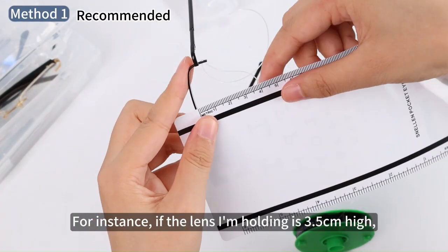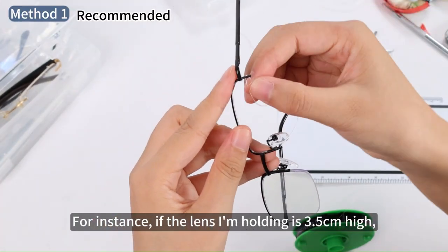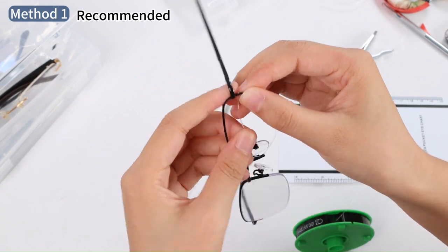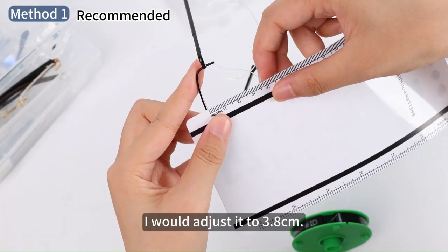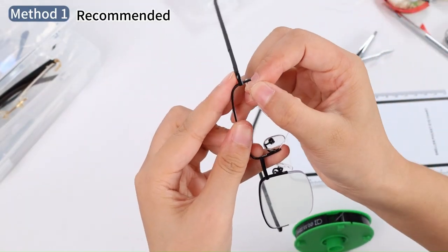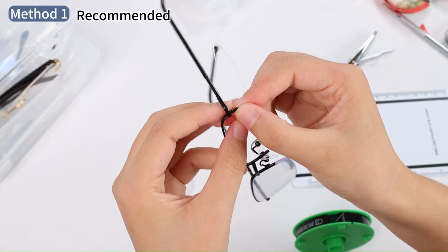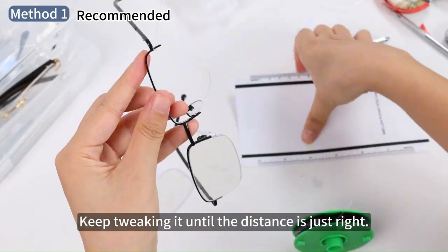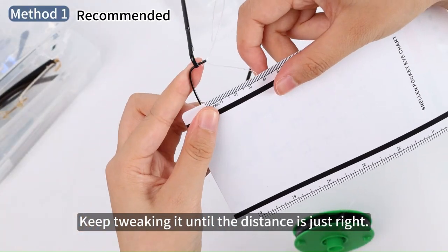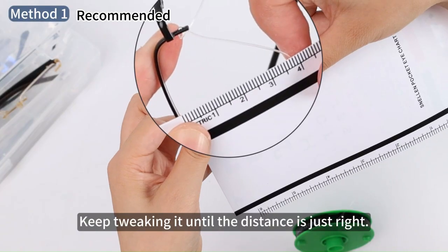For instance, if the lens I'm holding is 3.5cm high, I would adjust it to 3.8cm. Keep tweaking it until the distance is just right. I've got the cord in the right position now.